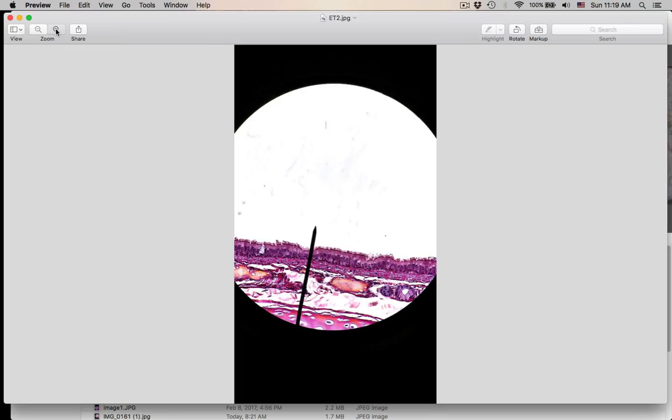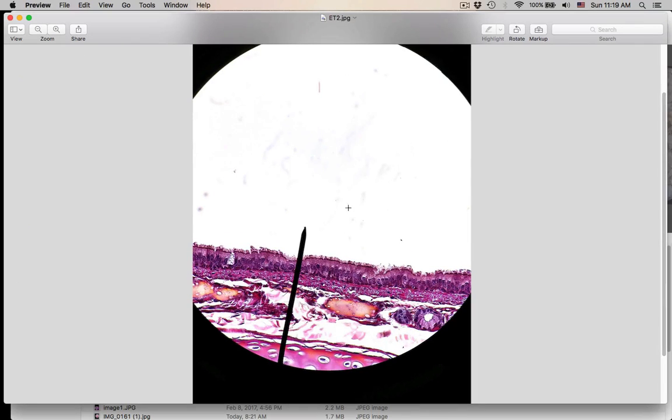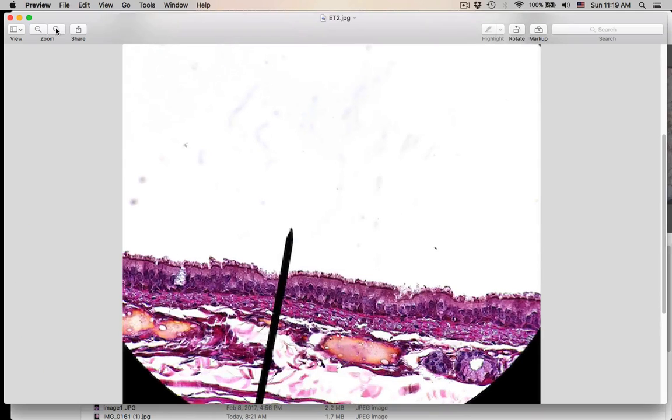Let me go a little bit higher. Pointer again in the lumen here. This one's real easy to see. What is the name of this epithelial tissue that is facing the lumen? This is number 10. Write the whole thing out. That was number 10.